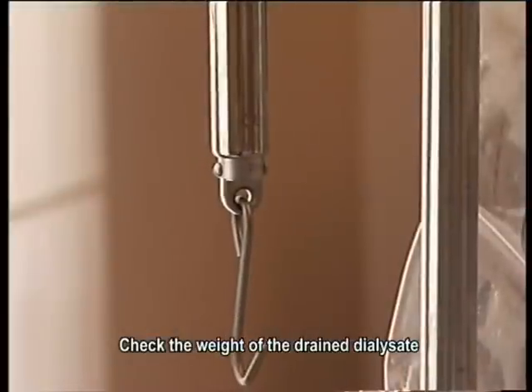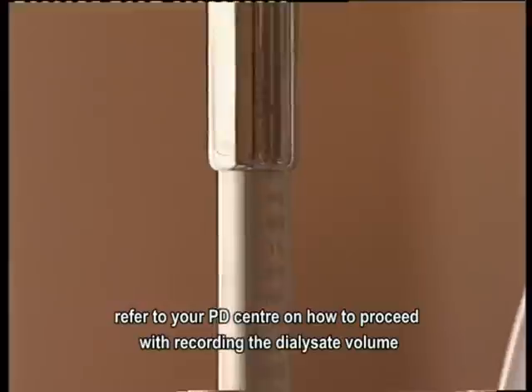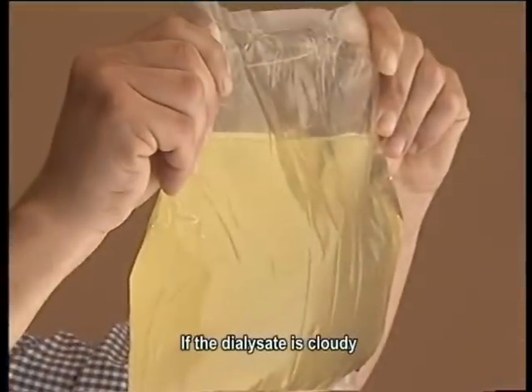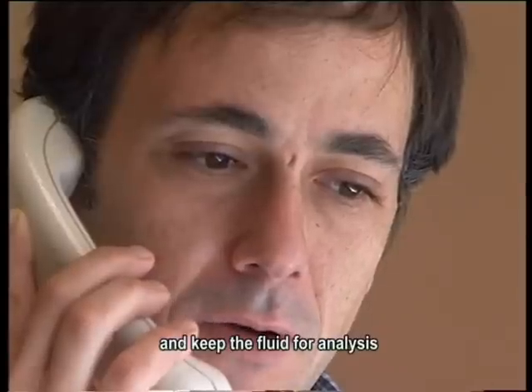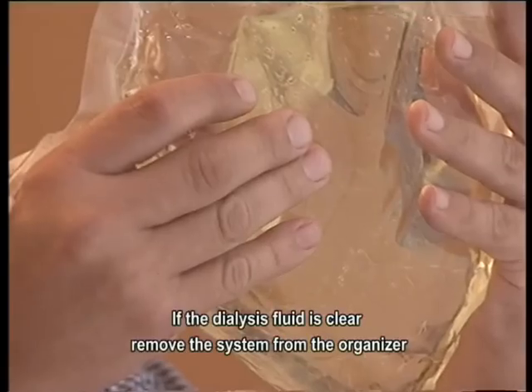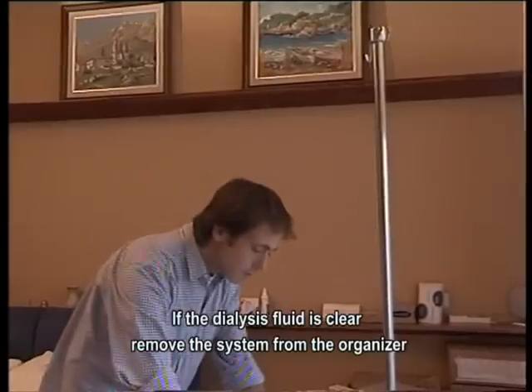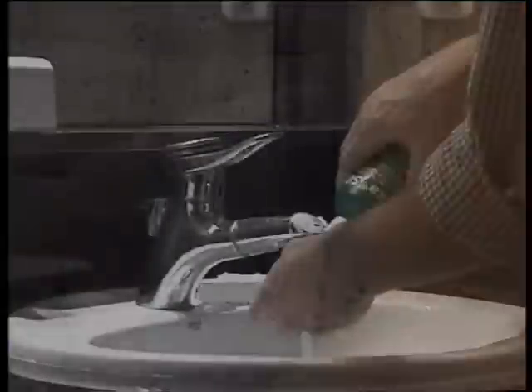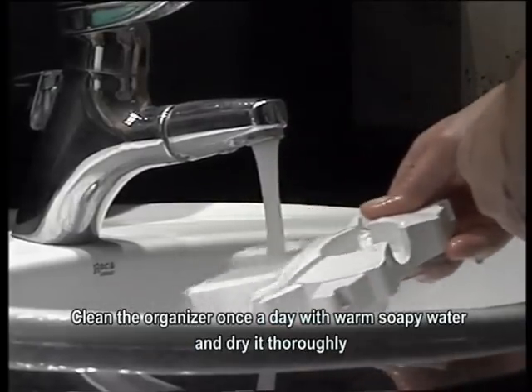Check the weight of the drained dialysate. Refer to your PD center on how to proceed with recording the dialysate volume. If the dialysate is cloudy, please contact your PD center immediately and keep the fluid for analysis. If the dialysis fluid is clear, remove the system from the organizer. Discard the fluid and the empty lines and bags. Clean the organizer once a day with warm soapy water and dry it thoroughly.